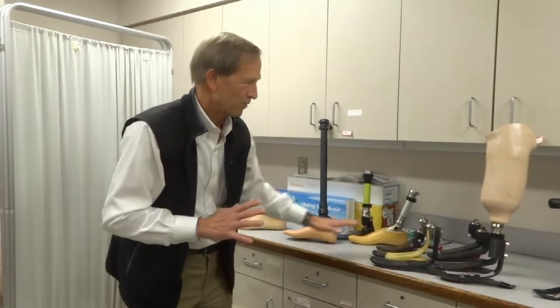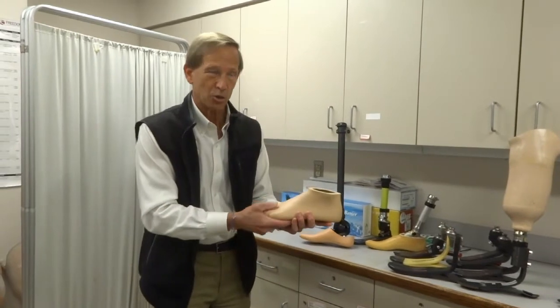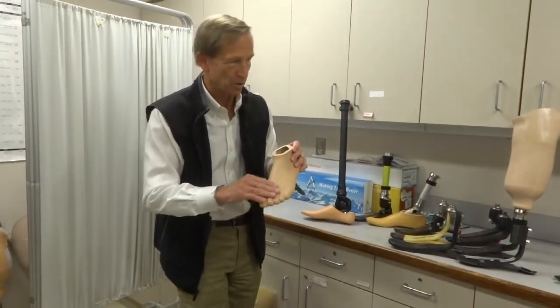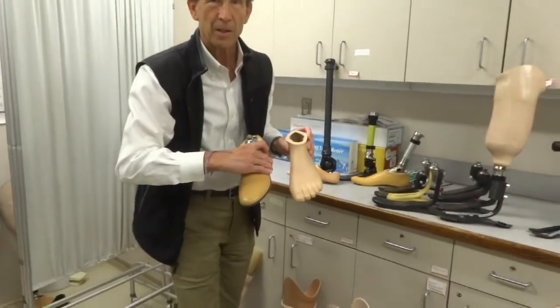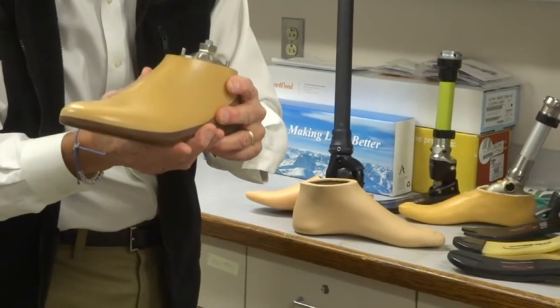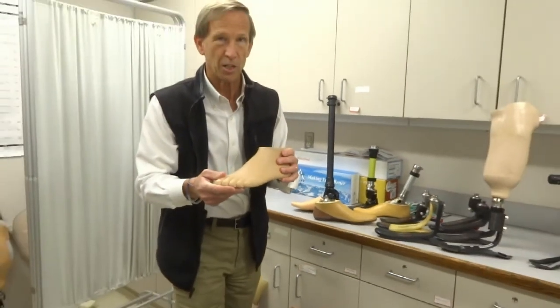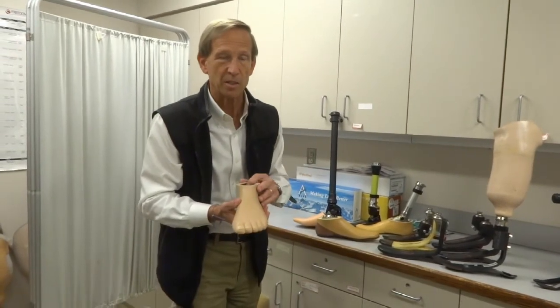These all look very mechanical and kind of ugly, but all of them are covered with a rubber shell — so no matter what they look like underneath, they'll all have this type of shell. You should also know that sometimes they come with toes and sometimes they don't. The one with no toes slides into a shoe much more easily, but the one with toes looks much better when you wear a sandal with the toes exposed. It's just one more question to ask your prosthetist: what does the foot shell look like when it's done?